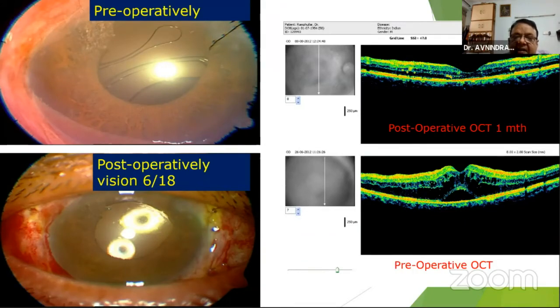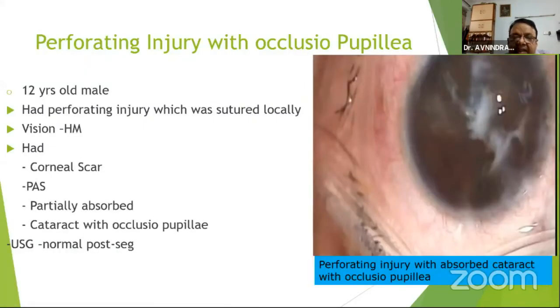But once scleral fixated IOL came, everyone devised their own technique, like Yamane's technique or Rajesh's technique or the glued IOL technique, to do a scleral fixated IOL. Basically, the aim of the technique is to fix the haptic into the scleral pocket, which makes the lens absolutely rock stable.